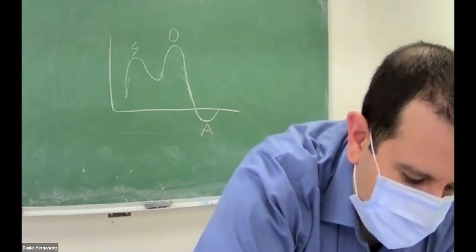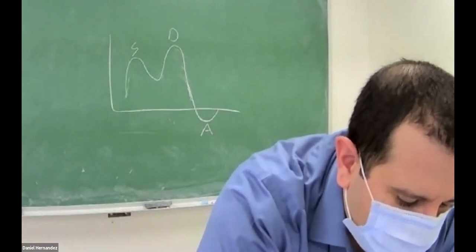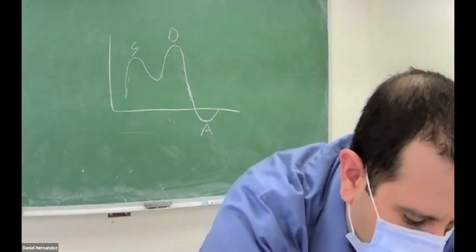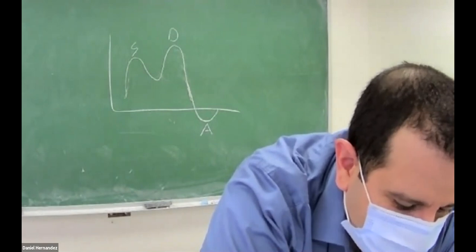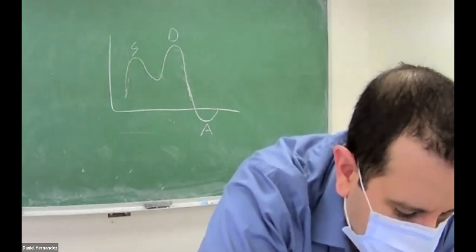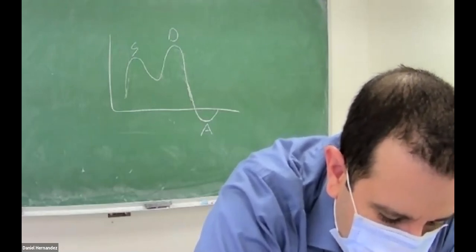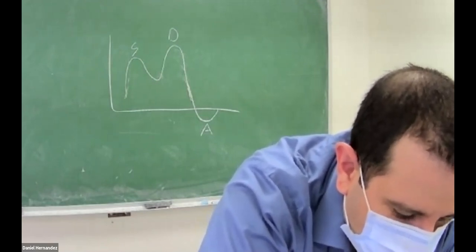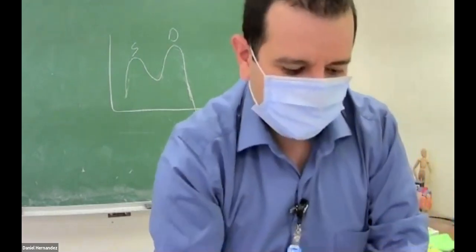Which of the following best describes the appearance of a ventricular aneurysm? We have a chronic contained ventricular rupture, a hole between the two ventricles due to ischemia, a hyperdynamic left ventricular wall with exaggerated systolic contour, a dyskinetic region with abnormal contour, or laminated thrombus along the ventricular wall.